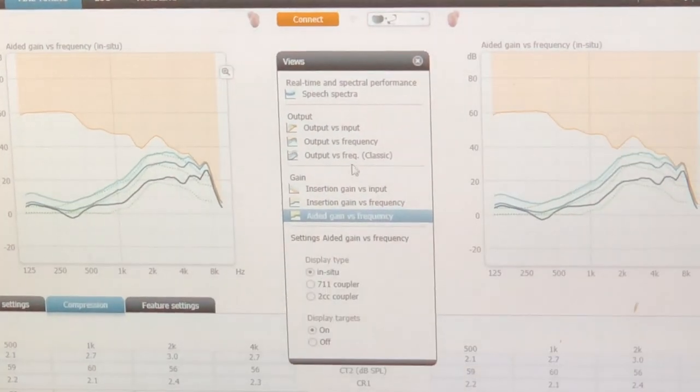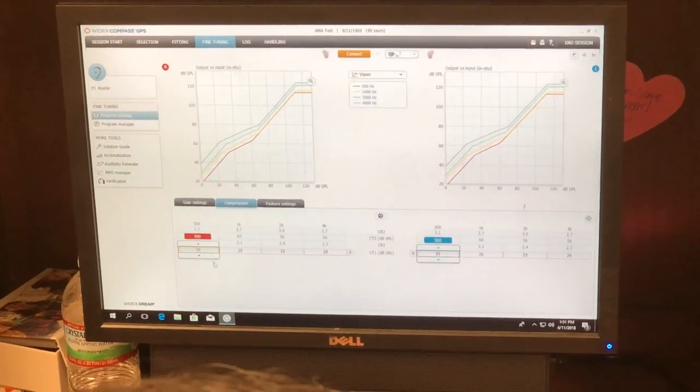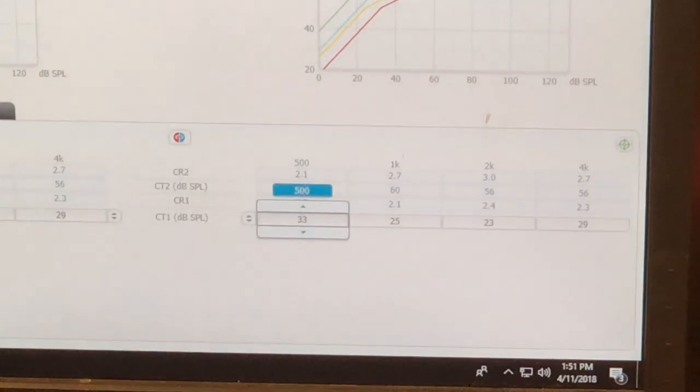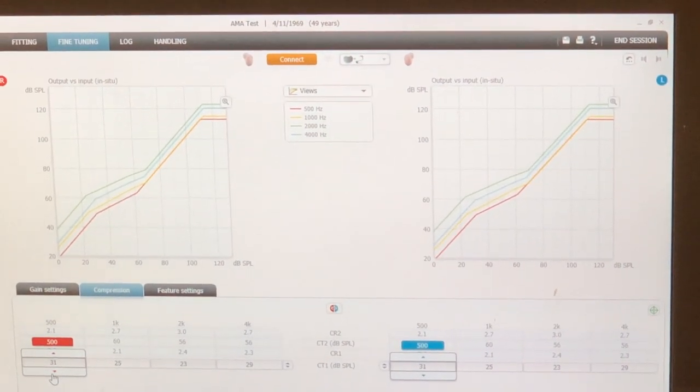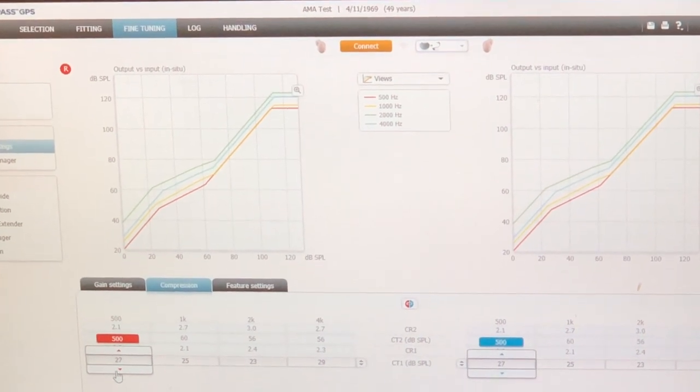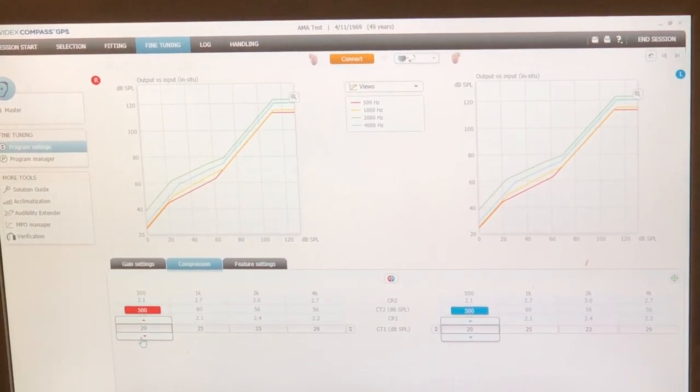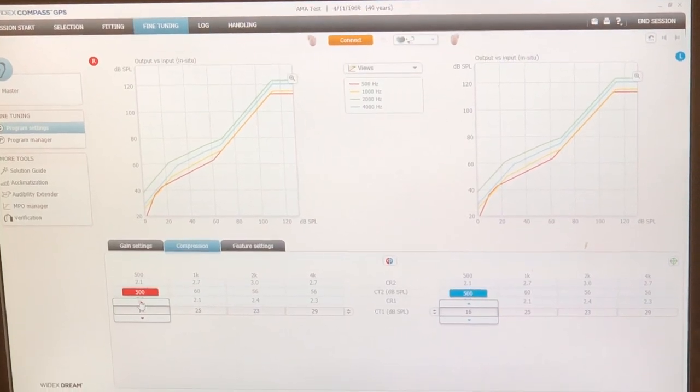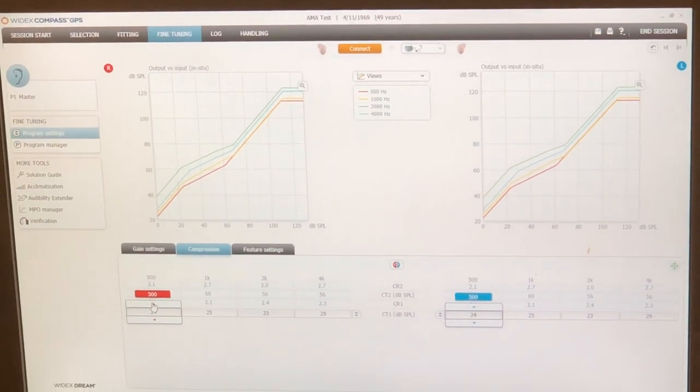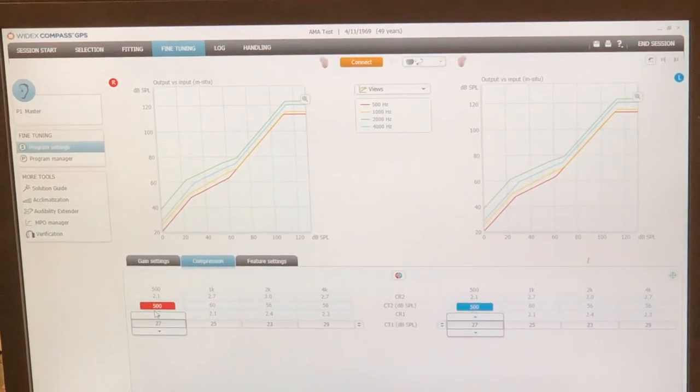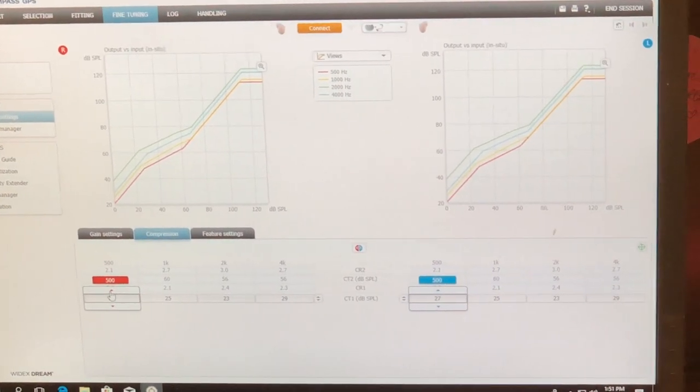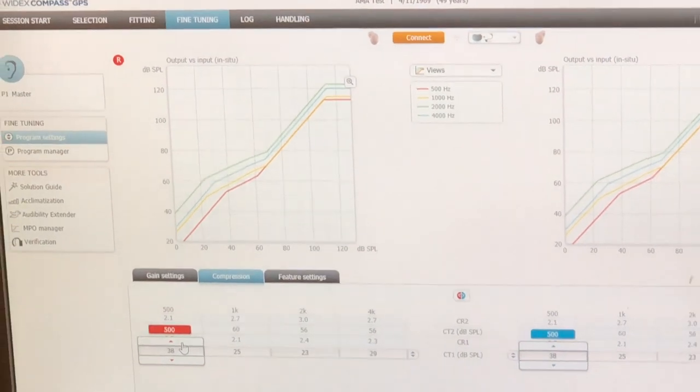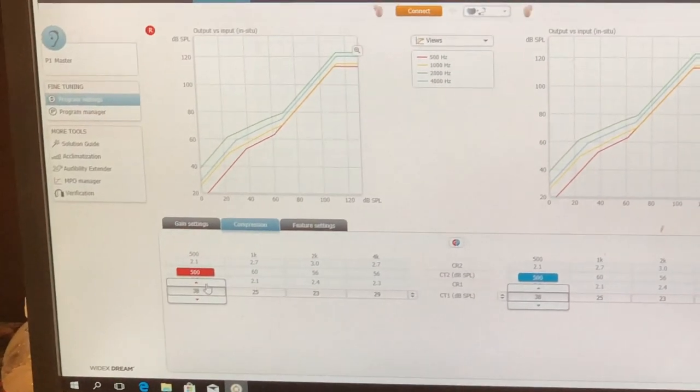If I go in here at 500 Hertz, which is the red, watch what happens if I reduce the number. Look at this curve. What's happening to gain? Is it going up or down? Looks like it's going up. It's going up. So as I reduce my knee point, you'll do this in amp two. As I reduce my knee point, gain goes up. If I increase my knee point, what happens? Gain goes down. Look at this. I'm going to increase it. Gain's going down. It's backwards. So you have to think the opposite way.